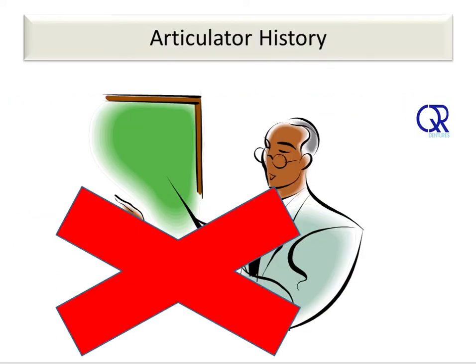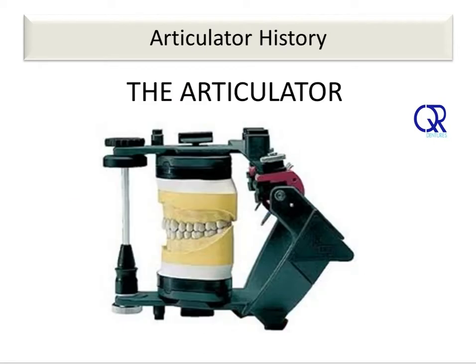Like many sciences, the history of dentistry is rarely taught in our training or even considered in our daily practice. This is particularly true of the development of articulators. Articulator manufacturers usually state that their articulators are based on the occlusal concepts of the Bonwill triangle, the curves of von Spee and Wilson or Monson, the Balkwill angle, and the Camper's line. Our clinical experience has led us to question the occlusal concepts that form the basis of most of our occlusal practice, and by implication, the nature of articulator design.